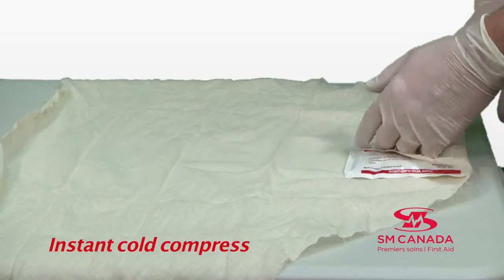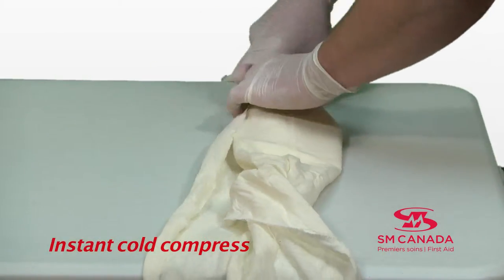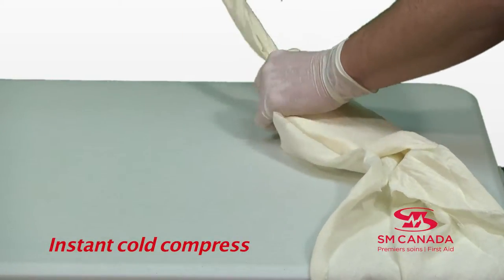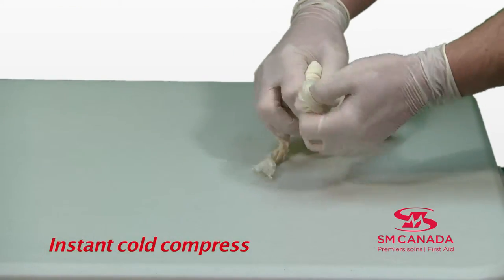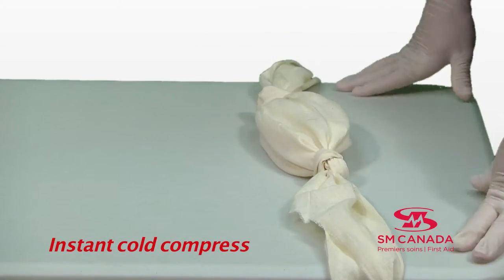A cold compress can be used to reduce inflammation, reduce bleeding, and also reduce pain. You can use a cold compress together with a triangular bandage. To do so, make a knot at each end of the bandage and apply the bandage onto the victim's body.